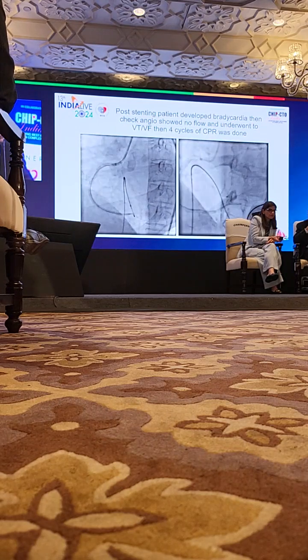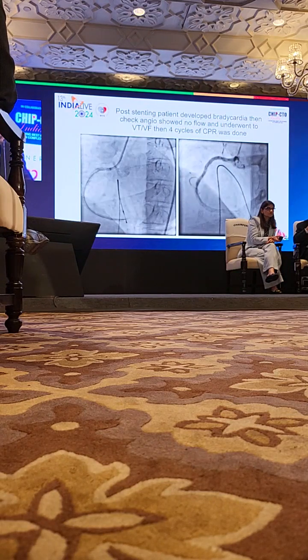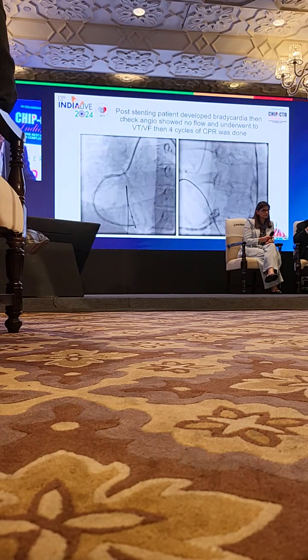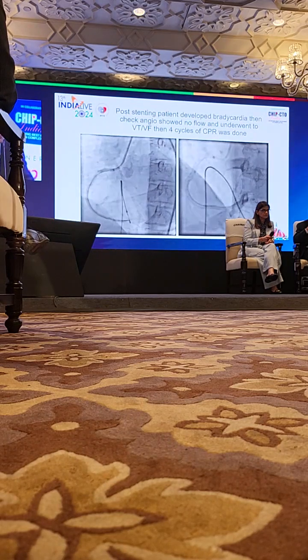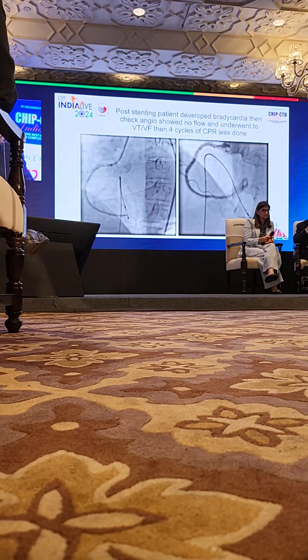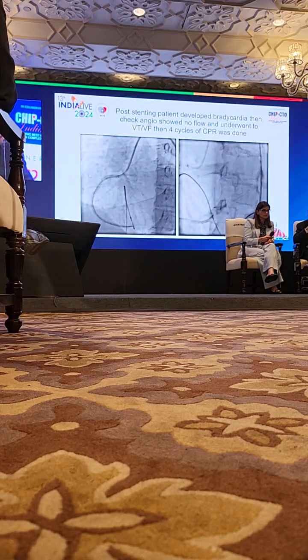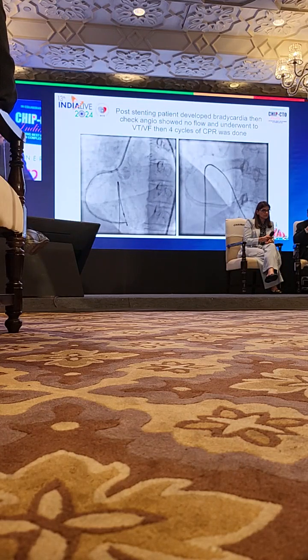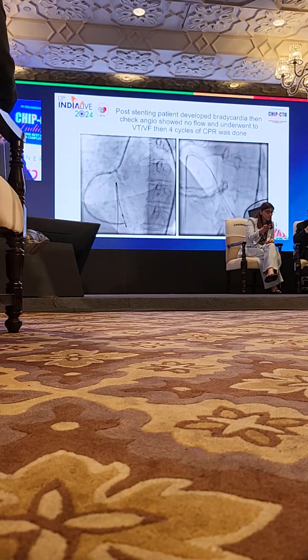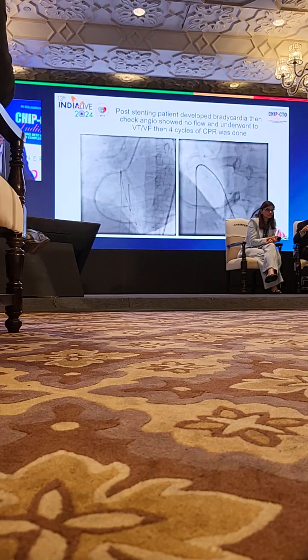So the most probable explanation is because you used the AL catheter. When you put the AL catheter and push it down, it causes acute severe AR. It must have caused compression on the aortic wall, and that caused the bradycardia and hypotension. When you have the guideliner there and you push the catheter more inside, it produces acute AR that causes bradycardia, hypotension, everything. Go back to this one. That is the cause.